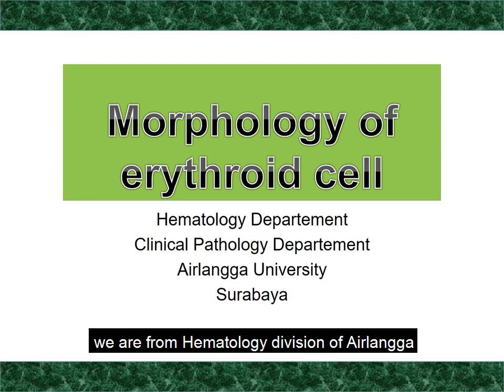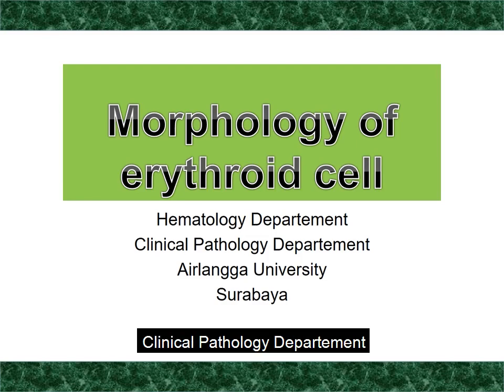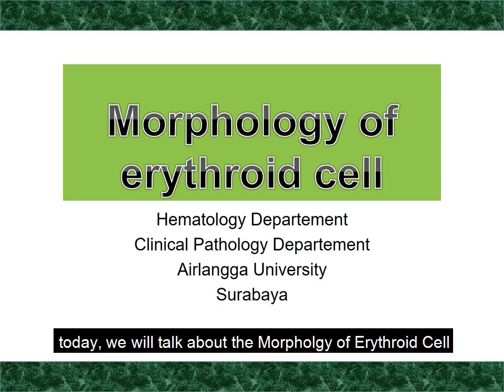We are from the Hematology Division of Airlangga Clinical Pathology Department. Today we will talk about the morphology of erythroid cell.